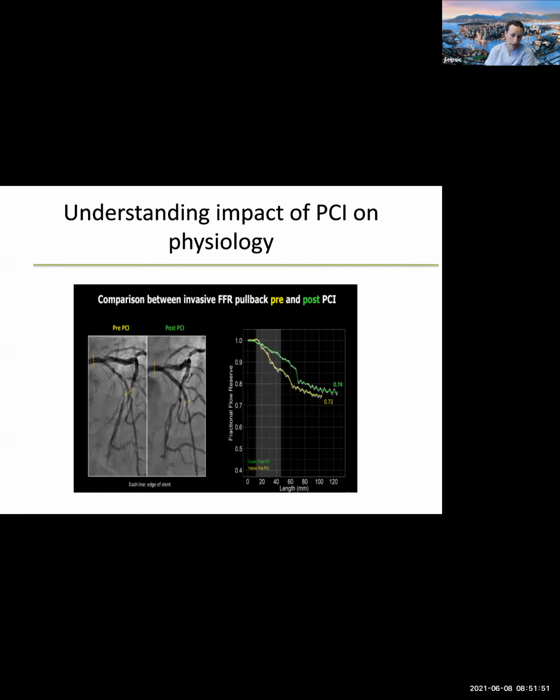But again, if we have a very high calcium score, we really make sure that we get that heart rate very low. And in addition, that we make sure that we have good nitroglycerin usage. We use 2 sprays. We wait at least 5 minutes. And we always use 120 kVp in the setting of calcium. If I even see any calcium, our techs are requested to uptitrate dose from 100 kVp to 120 to prevent partial volume averaging or blooming.